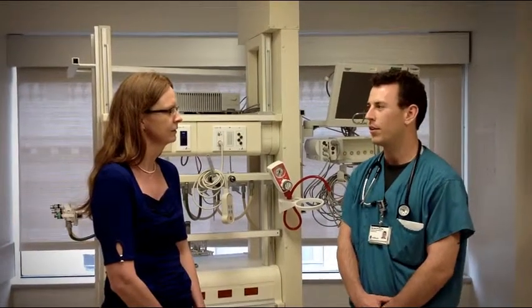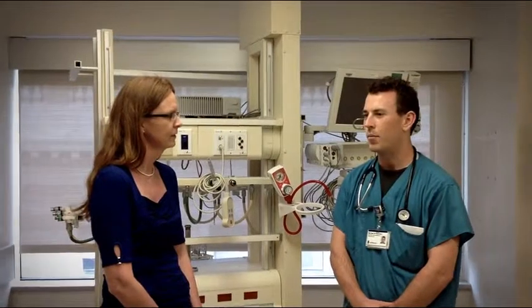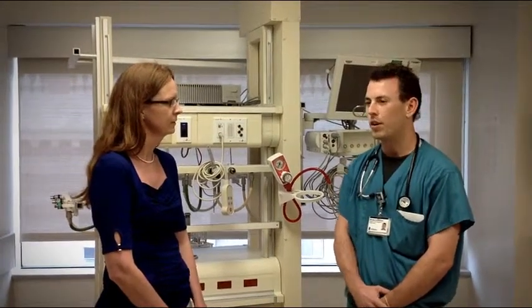What if their pulse ox is like 88%? Is that a reason? It could be. A good reason to be intubated is the patient's having problems ventilating. So if the blood gas is acidotic, then the ventilator can help fix that. But if someone's pulse ox is just low, you could use other modes of oxygen delivery to raise their pulse.